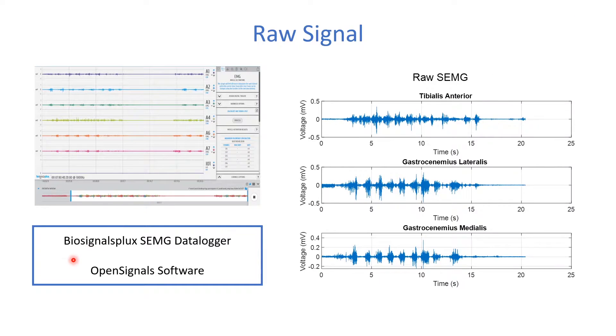For my experiments, I used a BioSignals Plux SEMG data logger with OpenSignal software. This is the screen on OpenSignals and you can see I had six channels, each corresponding to a pair of electrodes. And based on the data I got, I plotted the raw SEMG data for three channels or three muscles, which are the tibialis anterior, gastrocnemius lateralis and medialis. All this data processing was done on MATLAB and this is the raw SEMG data plot. Now, if you look at this, you can see a lot of distortion and sensor noise. So, the first step in processing this signal would be to filter it.